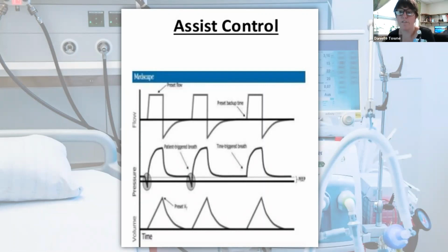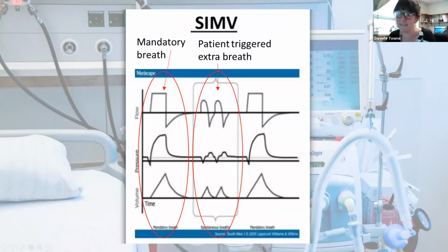It's making me take the full volume every time. So it makes patients very uncomfortable. They do not tolerate this well if they're not heavily sedated or paralyzed. That's where SIMV comes in. SIMV is also called synchronized intermittent mandatory ventilation.